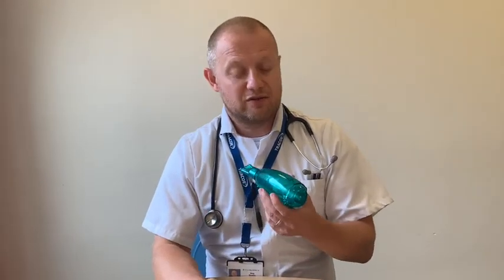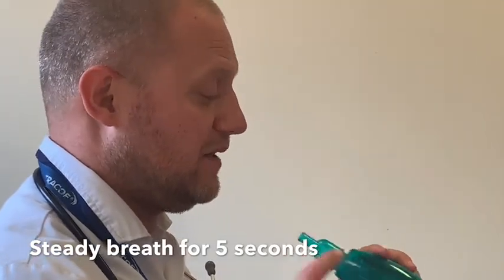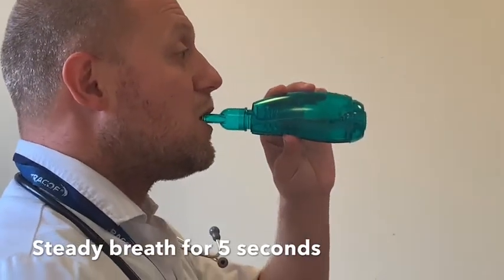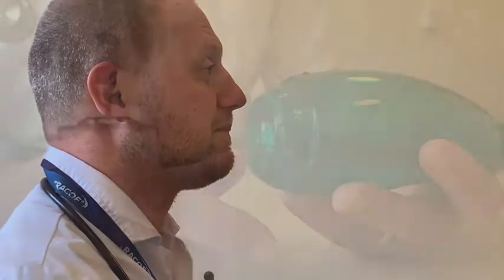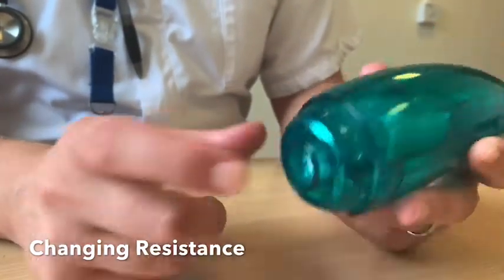Let me just show you how it works. What you want to do is blow through it at a constant pressure for around five seconds. That technique is a steady breath out through the mouthpiece at a constant rate for around five seconds. On the front of the device is a dial that should be set to three when you open it out of the packet.